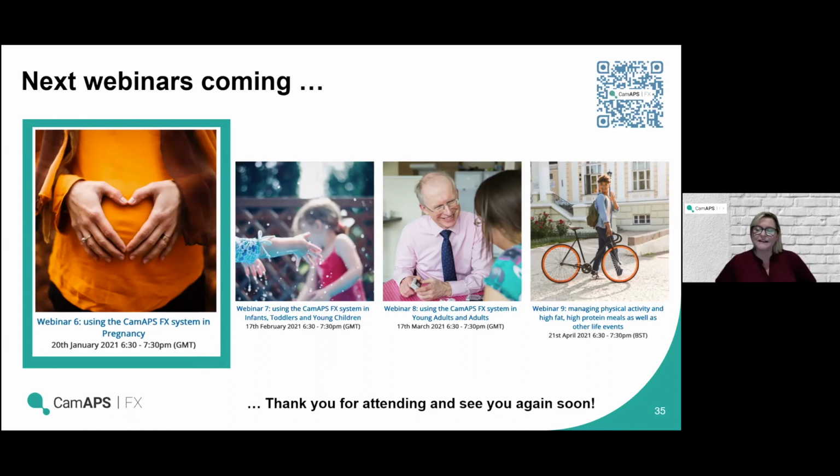Thank you. So here's a good scenario about Boost. If Boost has been on for half an hour and glucose levels are still rising, say over 15, with no food, the person sometimes gives a small bolus of, say, 0.2 as well as the Boost just to help it out. Should these be entered as fake carbs or just a bolus, this 0.2 extra correction? What would you recommend?